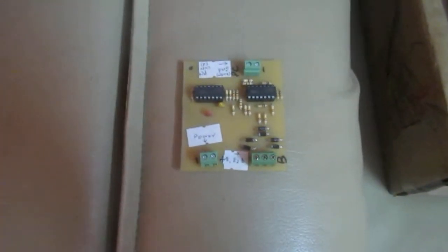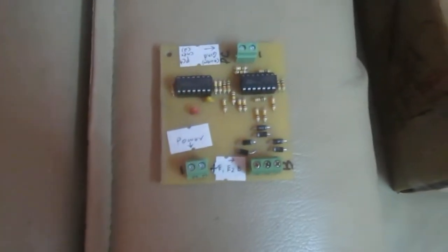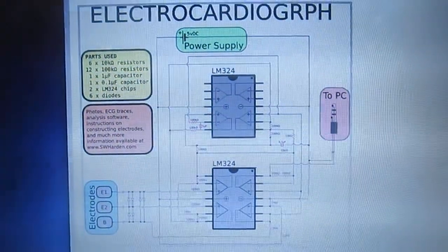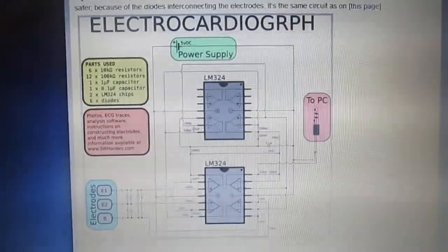This is a homemade ECG sensor, made based on this circuit design. It is from this website.